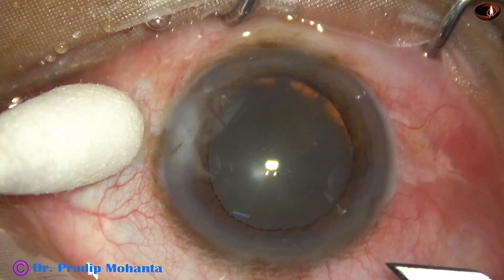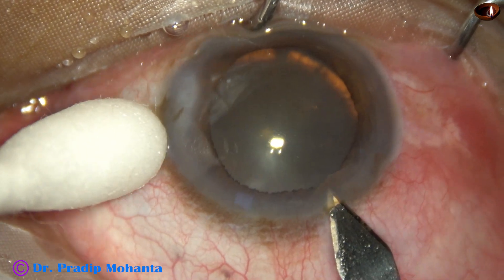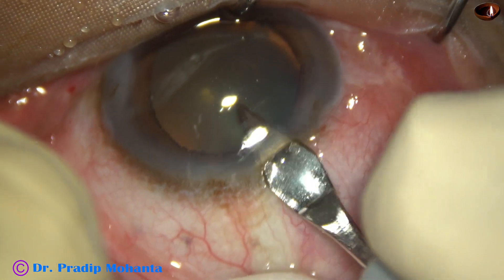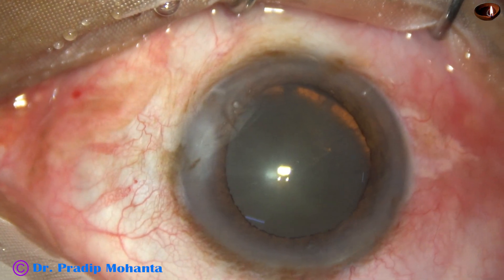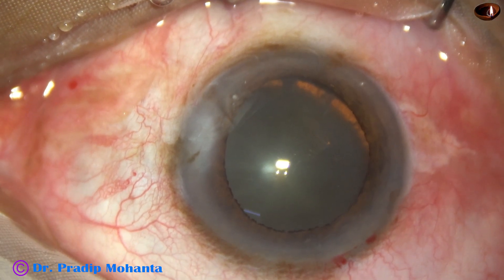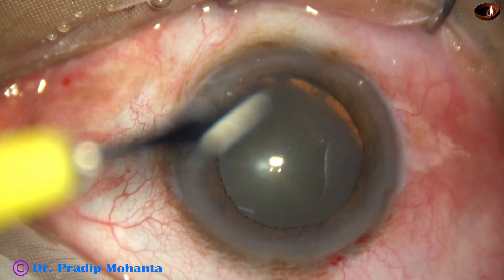This is a cataract with zonular dehiscence from 5 o'clock to 9 o'clock — so 4 clock hours of zonular tear. The patient has a history of trauma and is a 56-year-old male. I have taken up this case for surgery.